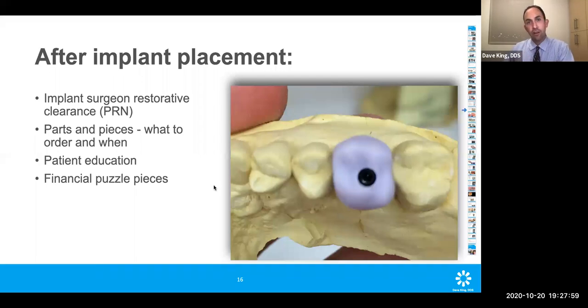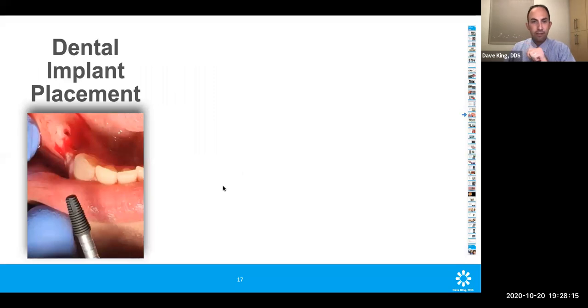So I like to do all of my implant crowns in office with our CEREC machine. We use a tie base, we scan, we design it, we manufacture them, whether it's a custom hybrid abutment or a hybrid abutment crown and it's screw retained or cemented, we try to manufacture them all in-house. So this one, I ordered the wrong piece, and I'll show you what happened.